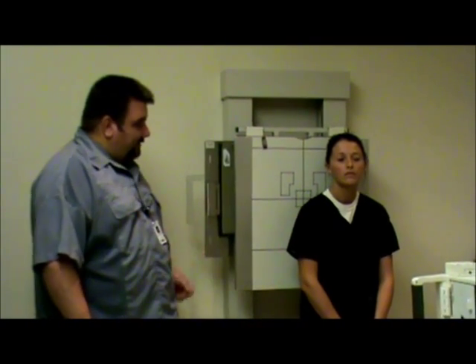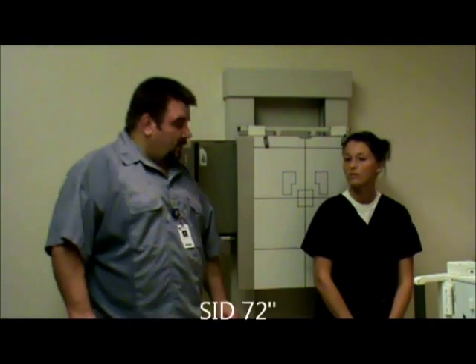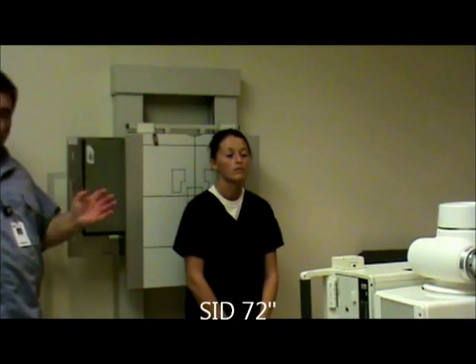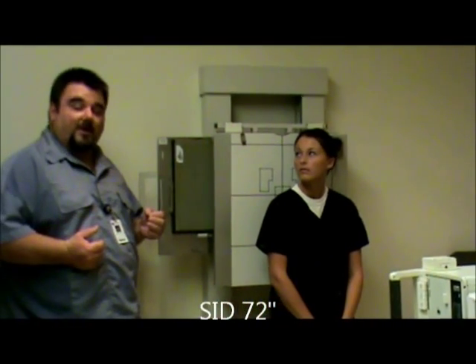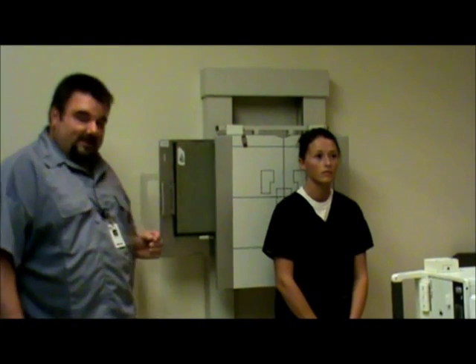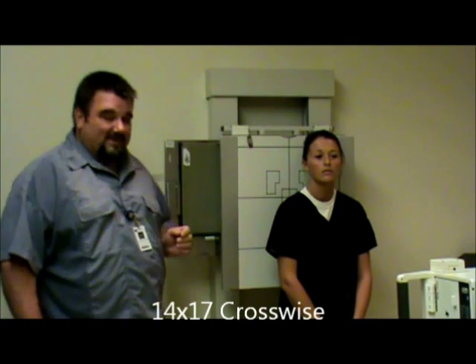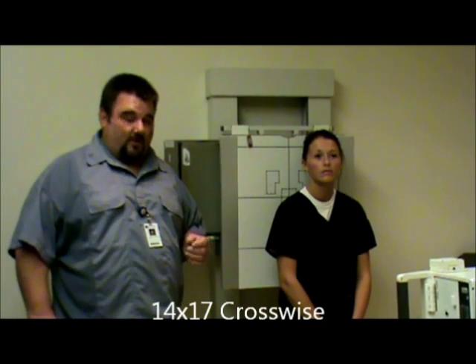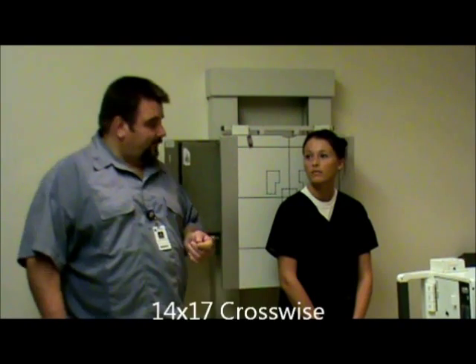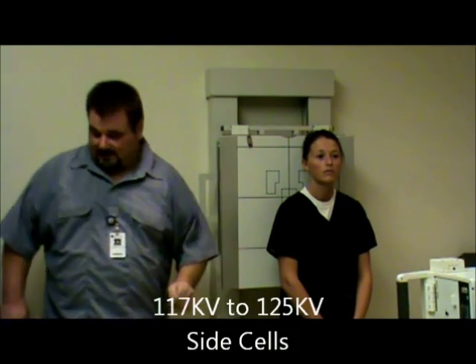Today we're going to be doing AC joints. The patient is going to be erect if possible. We're going to have a 72 inch SID. We're trying to include all the pertinent anatomy. This is a comparison x-ray — we're trying to see both AC joints on one film. Film size will be 14 by 17 crosswise. The technical factors will be 117 to 125, and we're using side cells. We are going to use both markers because we are doing this as a comparison x-ray.